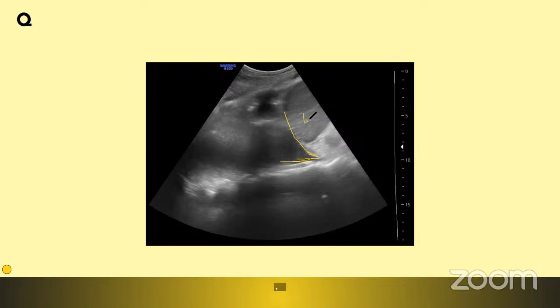This is the liver. This is possibly the lung tissue. And this is not my concern. Main concern is this one. If you see carefully, I'm able to do a demarcation like this, right? And if you are more imaginative, I can just split it.